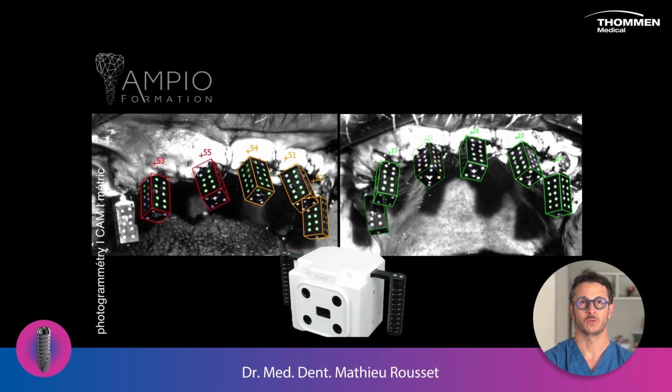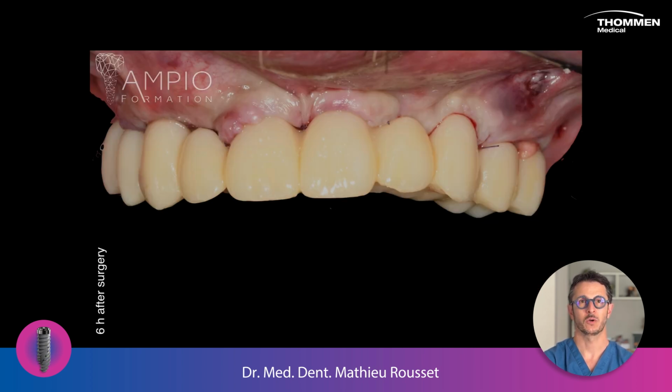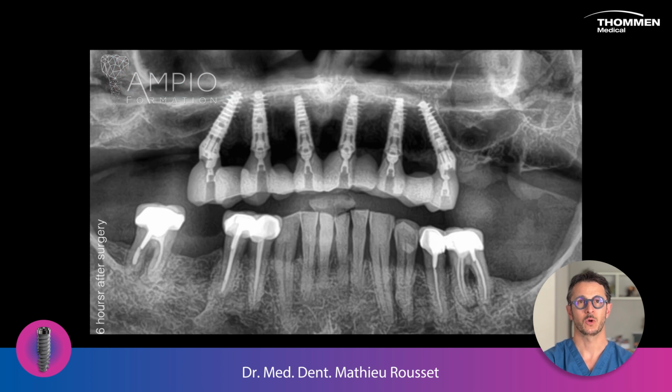All the data is sent to the prosthetist at the end of the morning. It takes him less than an hour to design the temporary bridge. The bridge is printed chairside. The patient is called back in the afternoon to install his bridge. The X-ray control shows a good bone level. In conclusion, the Nevo enables us to secure our immediate loading protocol thanks to an excellent primary stability without damaging the surrounding bone.